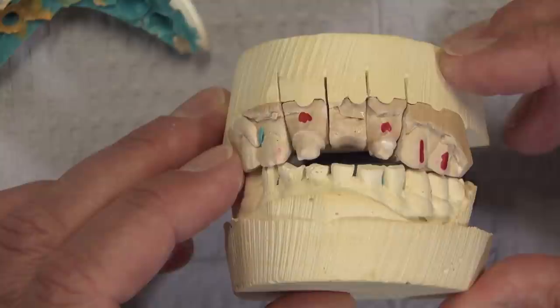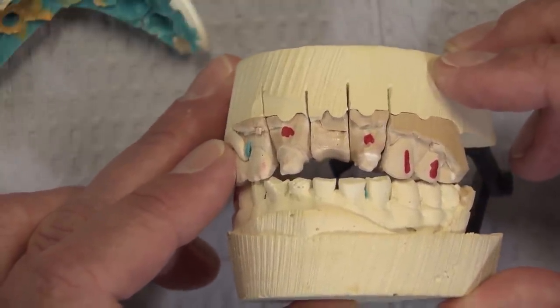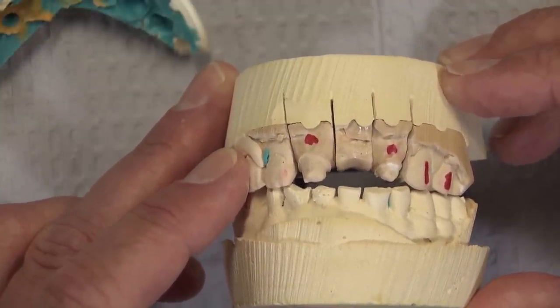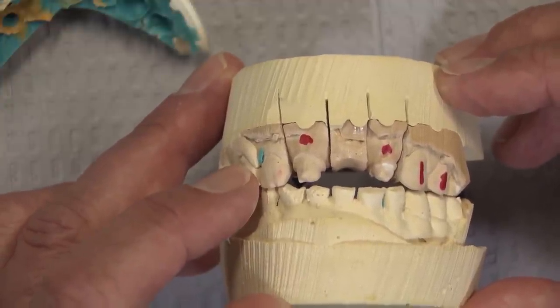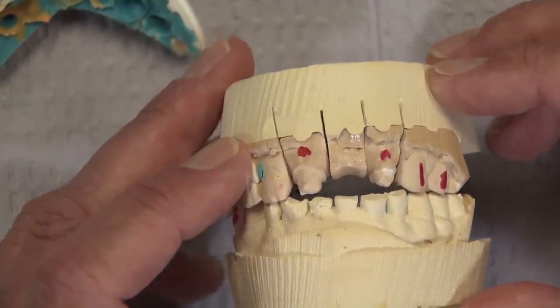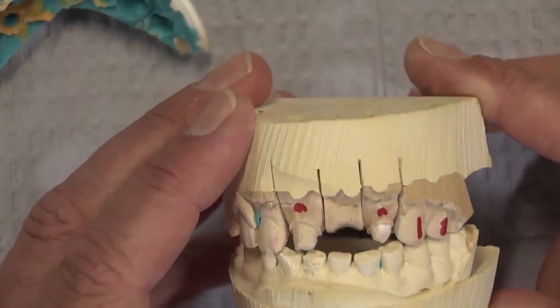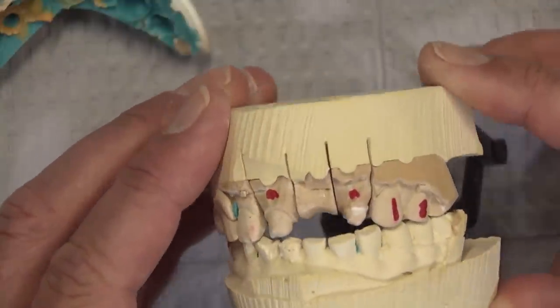Bruxer is a good choice here. For a three-unit anterior bridge, the first thing that might pop in your mind would be an emax press bridge, except that emax is contraindicated in patients who brux. So really, Bruxer is the right choice. In fact, anterior Bruxer would probably be strong enough for this, but if we are worried about fracture, regular Bruxer — which is what the doctor prescribed — would work here as well. So this is going to be a tricky one, but there's enough reduction to do a Bruxer bridge.